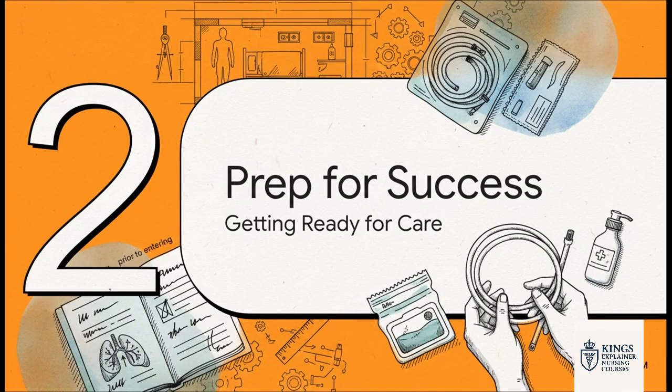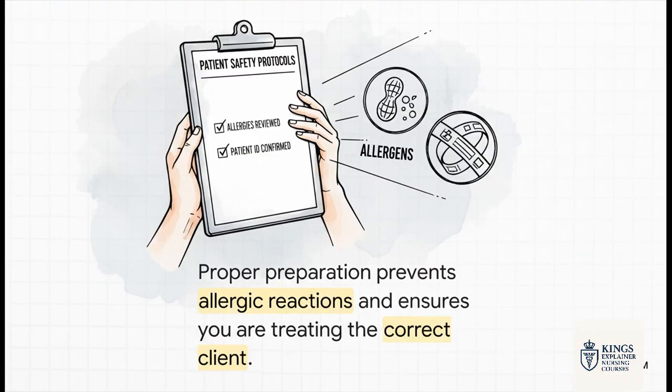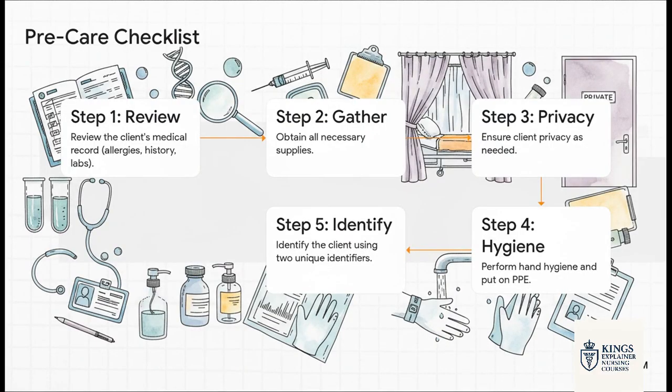All right, section 2. We've got the why down, so let's get into the how. And believe me, before you even step foot in that room, success and more importantly, patient safety, it all starts with solid preparation. Safety first, always. These checks you do beforehand are absolutely non-negotiable. This isn't just about ticking boxes to look organized. Nope, this is how we prevent really bad things from happening, like allergic reactions, or heaven forbid, doing something on the wrong patient. So think of this as your pre-flight checklist.